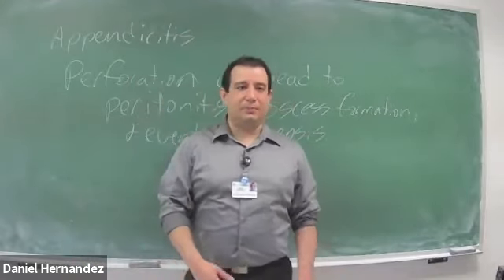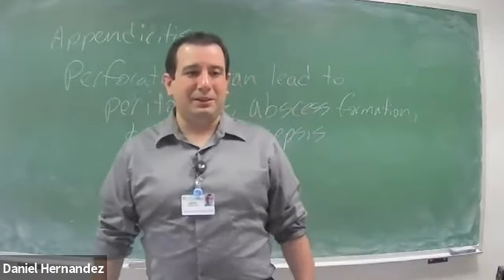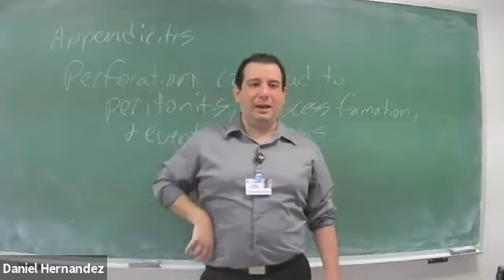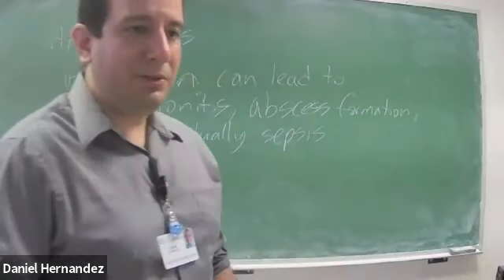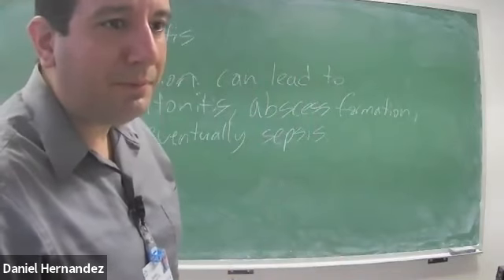So anywhere from the bladder up to the base of the liver and all the way out lateral. I've found appendixes very lateral, very medial, up high, low. So it's up to you to scan that right lower quadrant quite well.